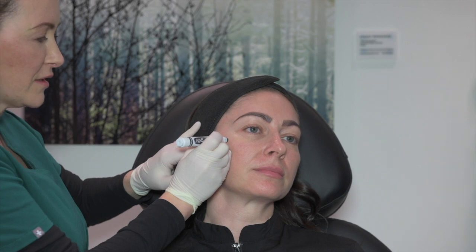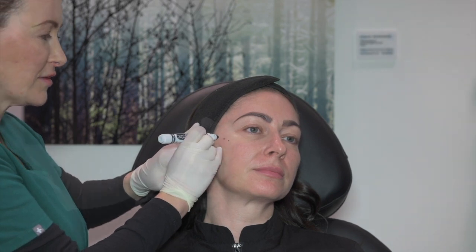So now we're going to move on to treating the patient. First of all, we're going to create the markings for CK1. CK1 is going to be 0.1, 0.1, 0.1 in Voluma. The marking for this is the suture line between the temporal and zygomatic bone. If you put your thumb into a little depression here, you can find it sits in the little depression of the suture line. Then the next CK1 points are a centimetre anteriorly and a centimetre posteriorly.